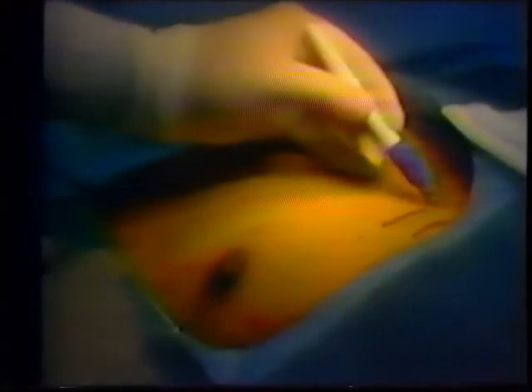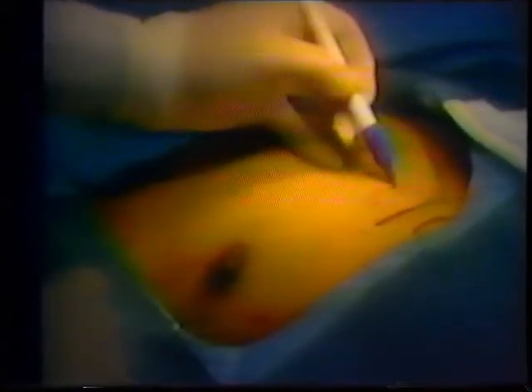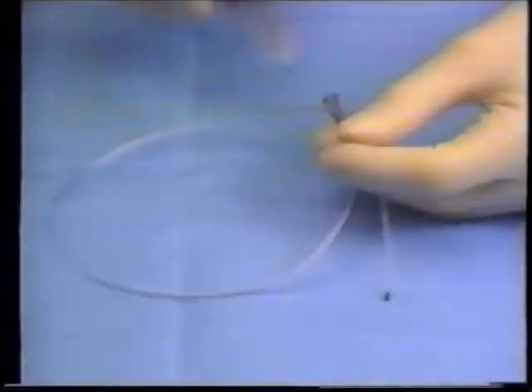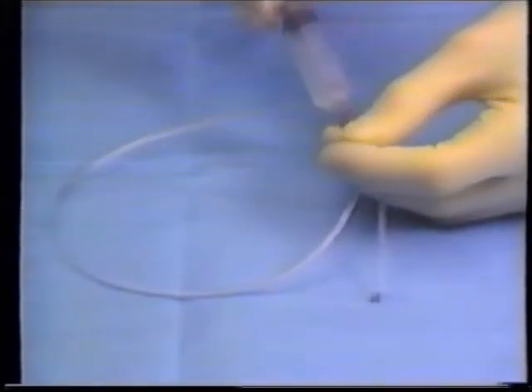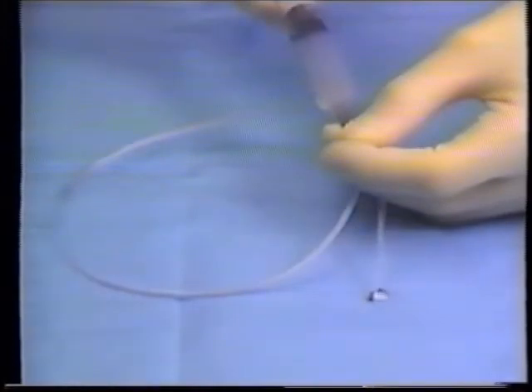The patient is prepped, draped, and anesthetized using normal hospital protocol. For best results, the port pocket location as well as the catheter route should be predetermined and marked. The port pocket should be placed so that the port rests on an underlying bony structure and patient mobility is not compromised. Attach the syringe directly to the stylet hub and flush the catheter, leaving it saline locked.